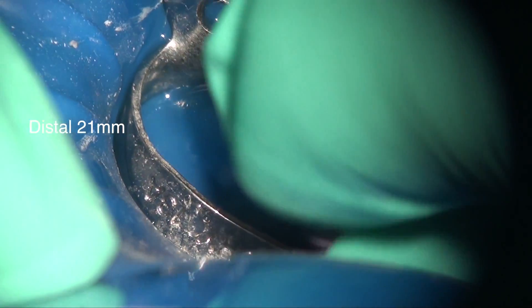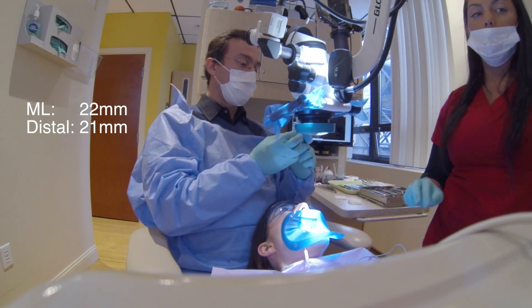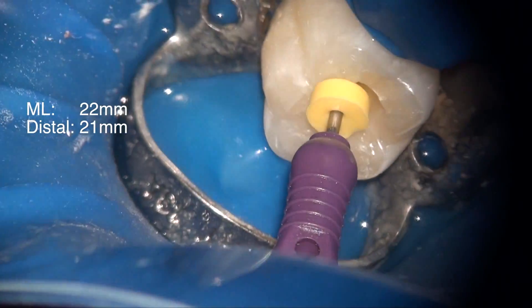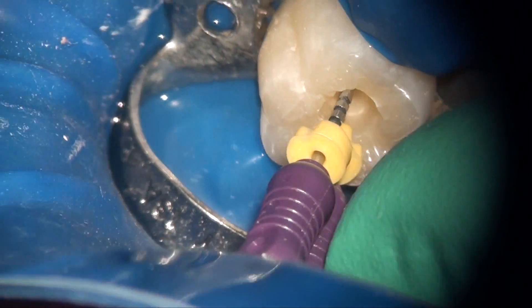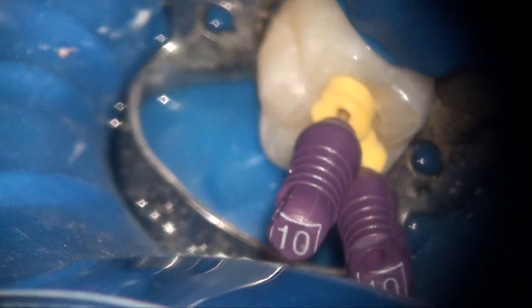On the distal I found a working length of 21 millimeters. An estimated working length is good because it gives you guidelines as to how far you can go and how short you should stay before you do your instrumentation. We measured the mesiolingual to be about 22 millimeters, and on the mesiobuccal we also measured it to be about 22 millimeters. So we are in the safe range — we estimated 20 to 22 millimeters, and we have 21 on the distal, 22 on the mesiolingual, and 22 on the mesiobuccal.